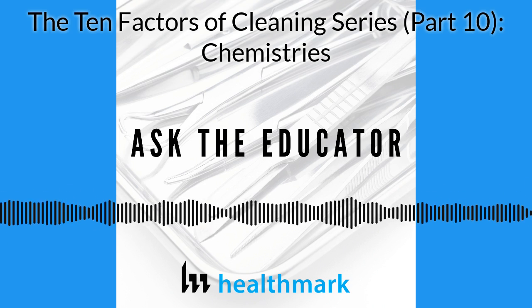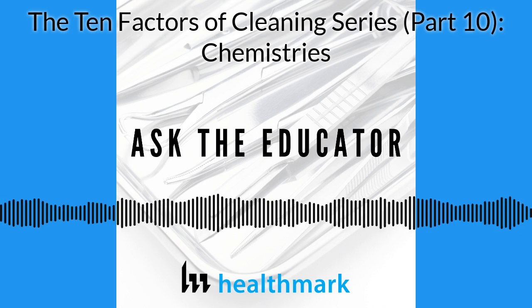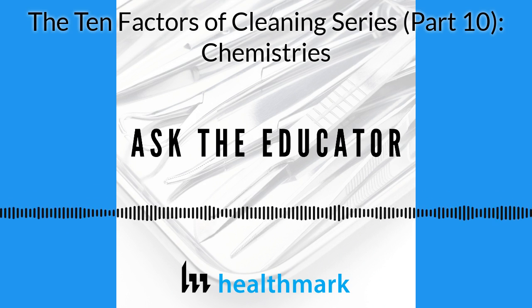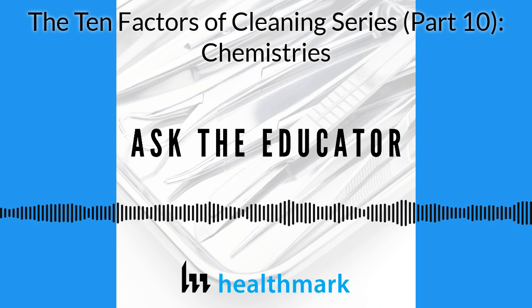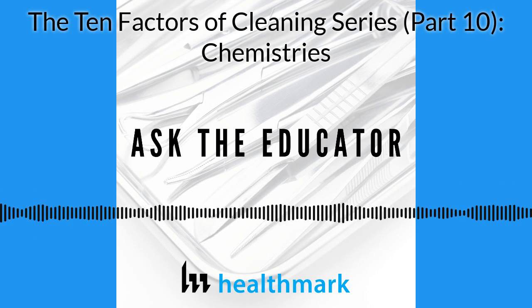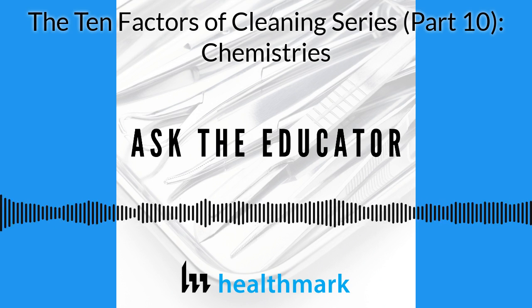It was simply a surfactant type of detergent. So yes, we were familiar with it, but I don't think it's something people widely discuss. It's almost always enzymatics and whether they're neutral or alkaline, because what you might run in the automated washer might be different than what you use at the decon sink, but surfactant is something I am a little more familiar with.